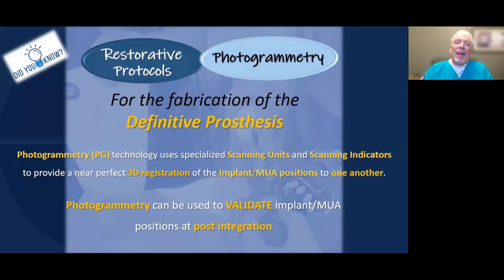I'm not going to get into all that detail. But if you have any questions, reach out to your laboratory and they can walk you through some of that. So the photogrammetry is going to be able to validate at the point of post integration the near perfect position. And I think the numbers are usually around 10 microns is what they're talking about as far as accuracy.